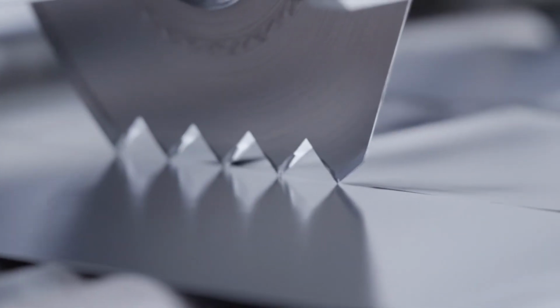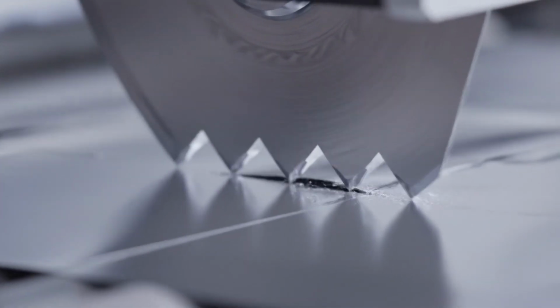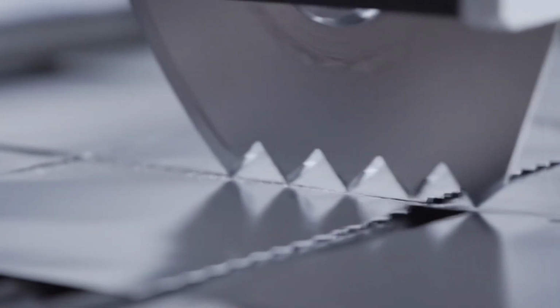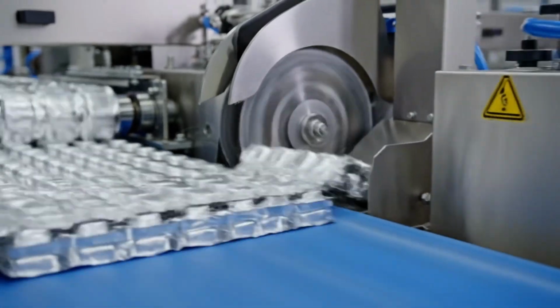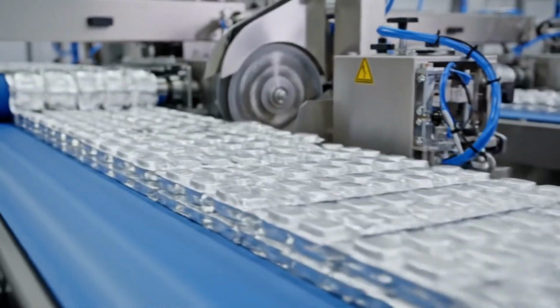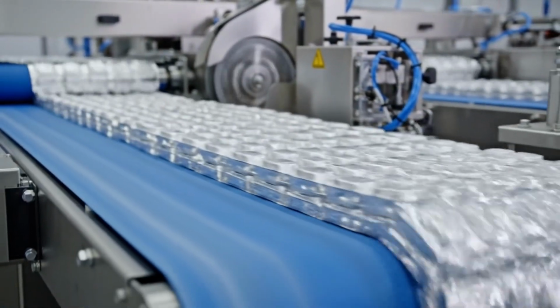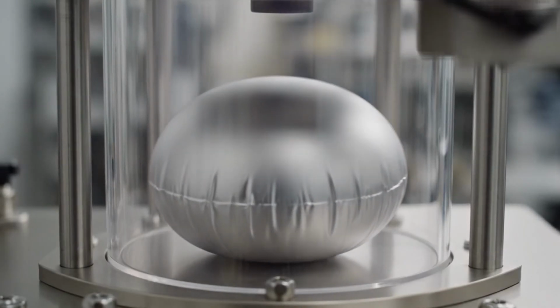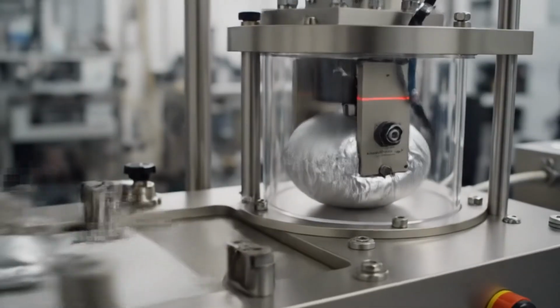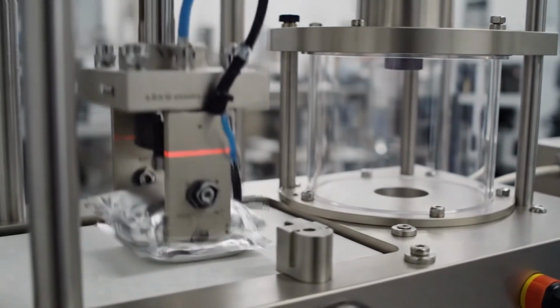Functional design is key. The serrated edge is engineered to tear perfectly every time. High-speed automation allows us to pack up to 400 condoms per minute on a single line. We even test the air inside the package. A failed seal means the lubricant could dry out or the rubber could degrade.